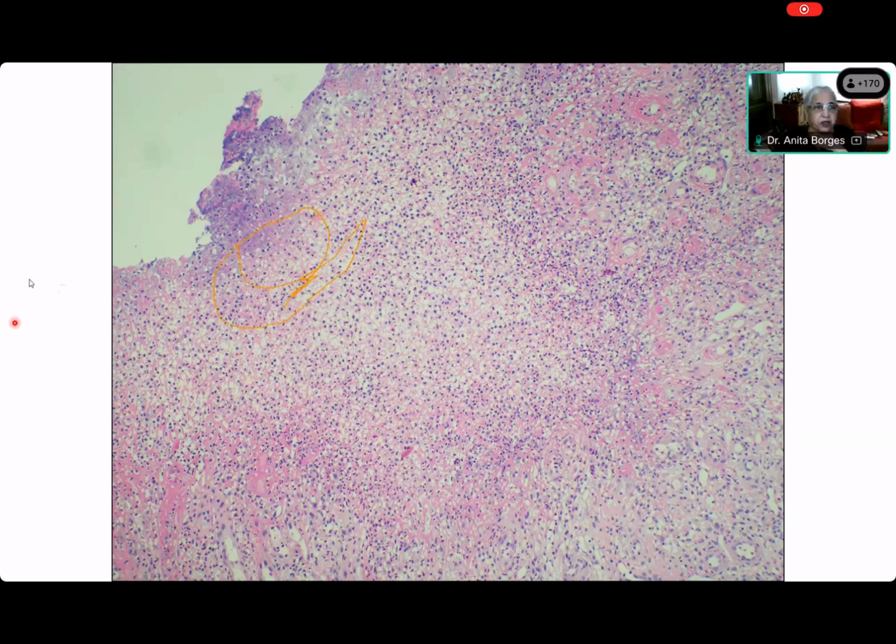Okay, you've drawn something here. Now I know what you're trying to show. You're saying this is the base of that ulcer. Yes, Deepali? Okay, continue. One minute. You are calling this the base of the ulcer. Elsa, is this the base of the ulcer? Sorry, ma'am. This one is the base of the ulcer. Which is the base of the ulcer? This one. You've drawn something here. This is the base of the ulcer, and this is the surface of the ulcer.